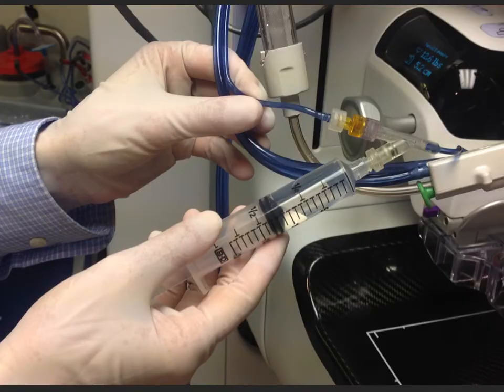This is to show you the point of attachment for the 1% lidocaine with epi syringe. Note that it goes onto the white tap, not the gold tap. The gold tap has the irrigation solution.